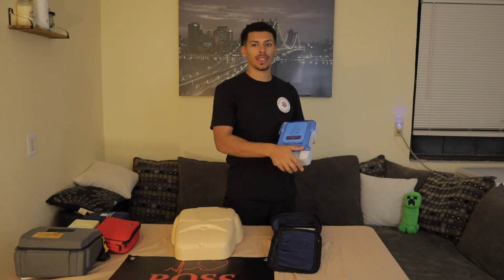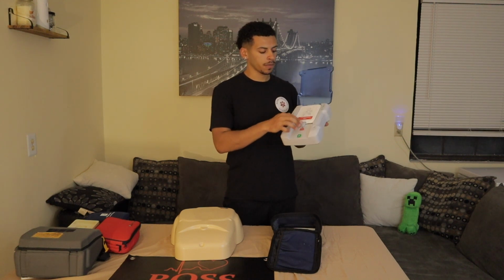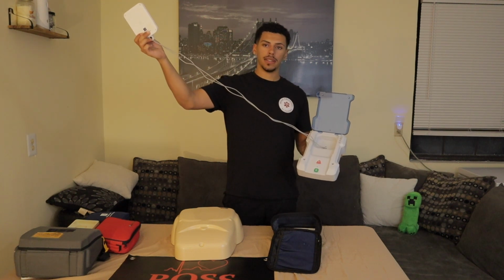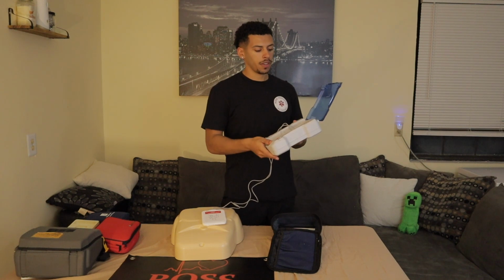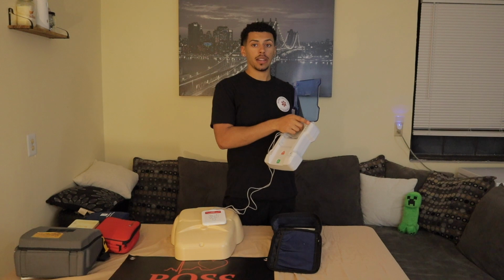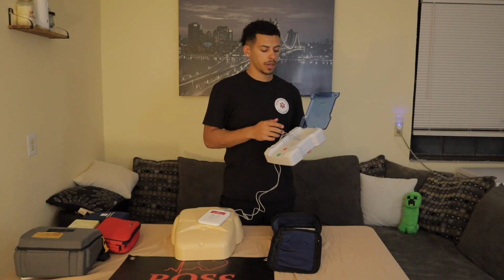So back to the front side, we'll just lift this cover, and then you'll see your 2 buttons down here, your turn on button and then your shock button. And then you have your AED pads with the wires already connected. And then you're going to have a few different buttons on here. You'll have one button that's just going to change the language. Then you'll have another button that just changes the scenarios you want to run.